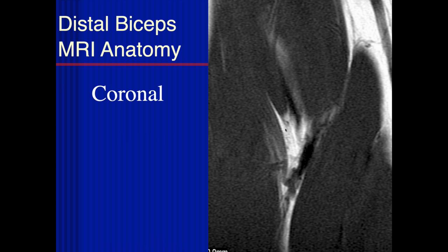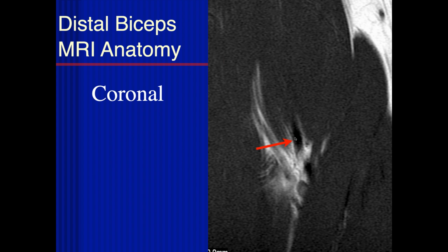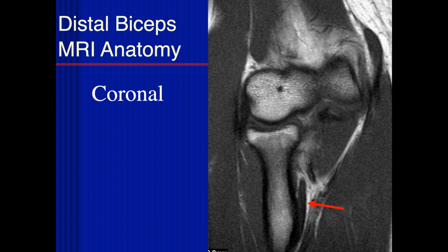So let's look at the anatomy on MR scan. Here's the coronal plane. Here's the biceps muscle. There's the distal tendon. There are two tendons from the short and long heads. Here's the pronator teres muscle and tendon right here. Here's the extensor muscle mass over on the opposite side. And then as you can follow on the coronal plane down here, this is the biceps tendon. Generally, you can see both of them, from the short and the long head, on the coronal plane if you look for it. You can follow it all the way down, and then there's the attachment, as we see here. And this is the radial tuberosity.